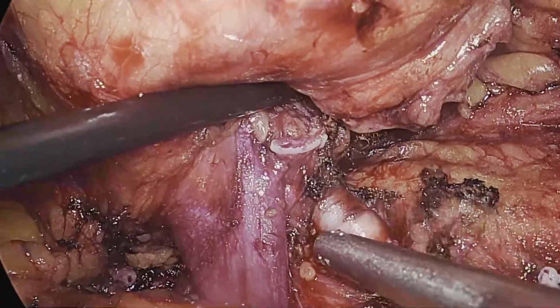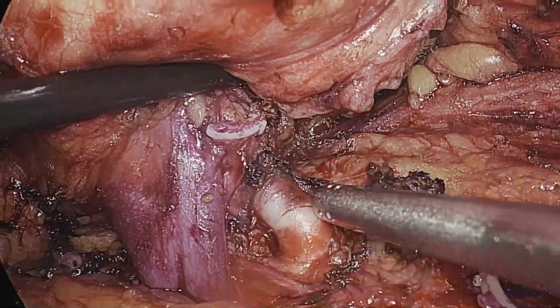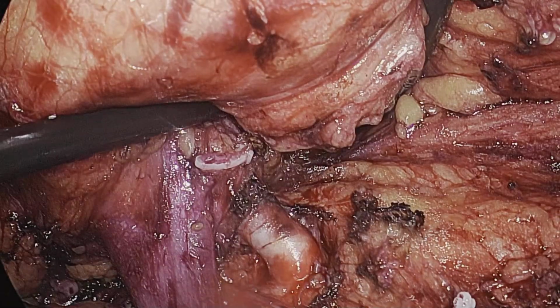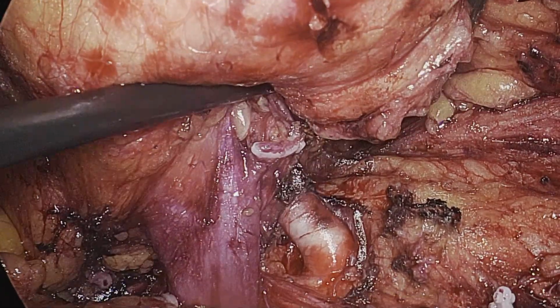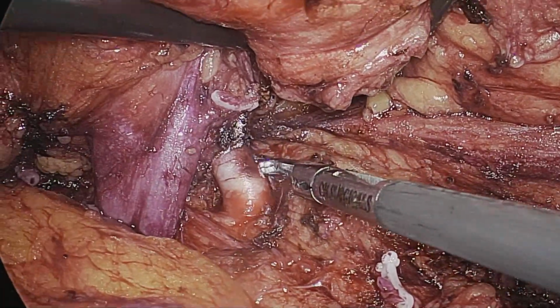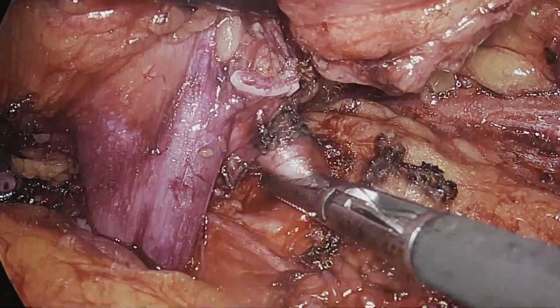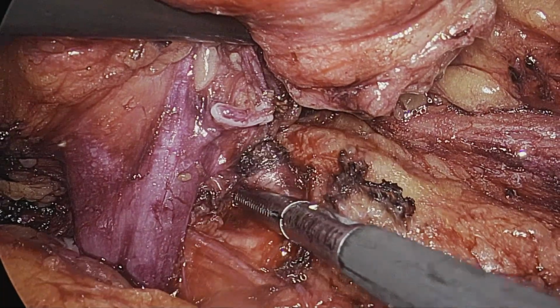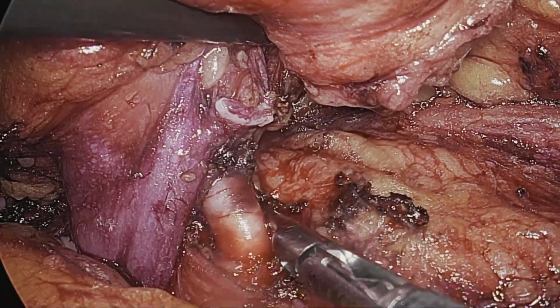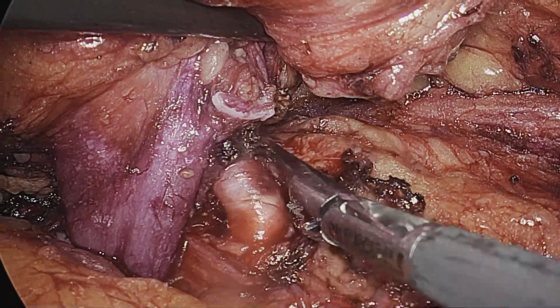We want to take the lymphatics around the hilum only. There is no role actually for a lymphatic dissection in a renal tumor. There is no proven role as such for a lymph nodal dissection. So para-aortic lymph nodes particularly are not dissected in a renal tumor, but at the same time, the hilar lymphatics do definitely have some role in renal tumors. So, for staging purposes, hilar lymphatics are taken along with the specimen in radical nephrectomies.